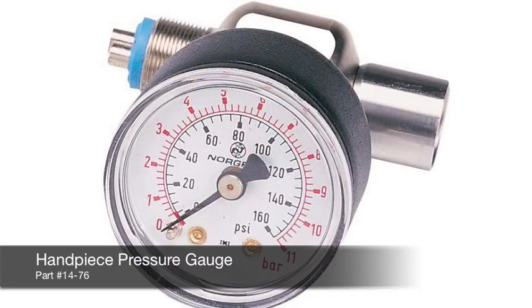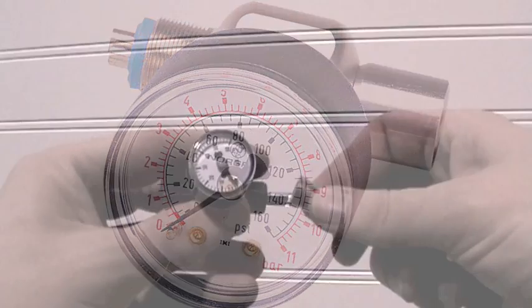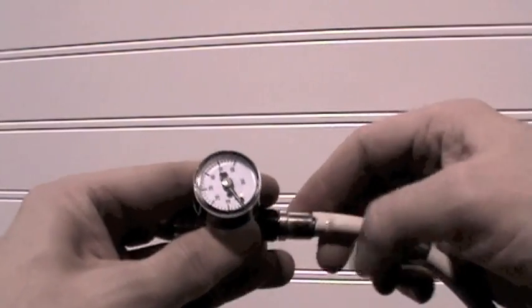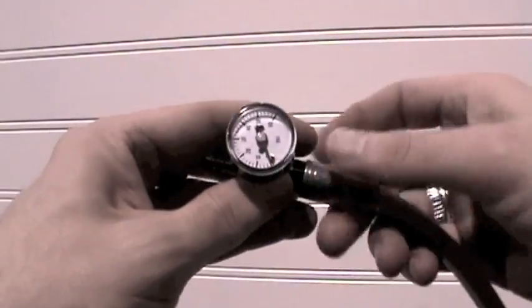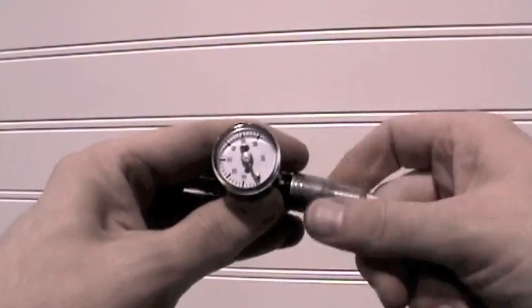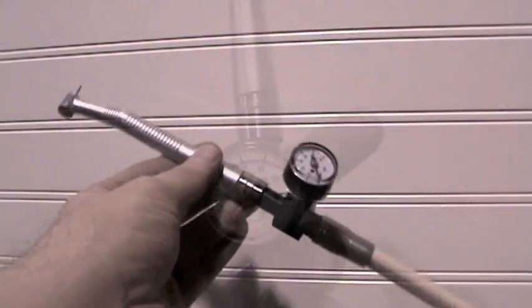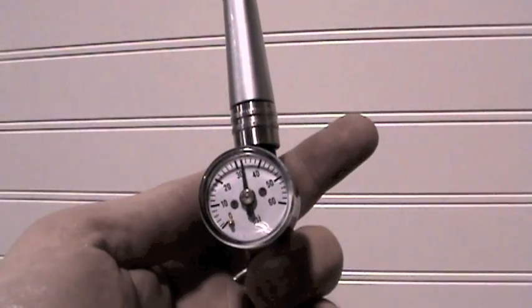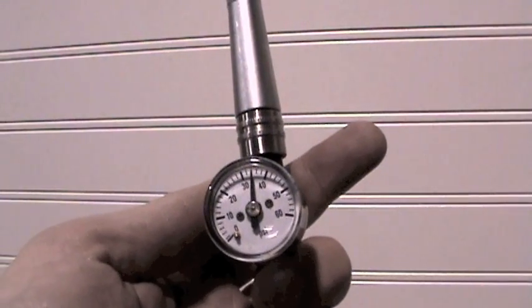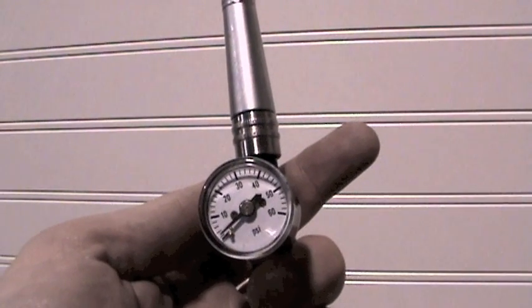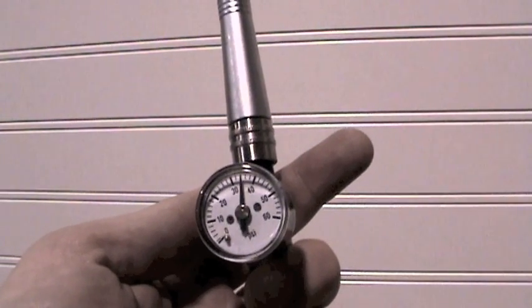In order to verify the pressure that is really coming through the handpiece hose, we suggest using a handpiece pressure gauge. You would use this device to set the correct pressure at your block. As you can see, the gauge on the hose reads about 32 PSI. So we were able to determine no adjustment was needed on the block at this time.